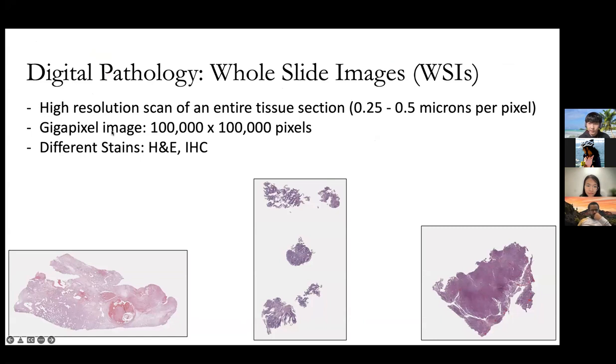As some folks might already know, there has been tremendous progress in whole slide imaging for histopathology over the past decade, so nowadays pathologists and researchers can view histological specimens at very high resolution right on their computers. Recent advances in computer vision and machine learning also helped fuel interest in large-scale quantitative image analysis of these images, both for knowledge discovery and to potentially assist in clinical decision-making. However, one of the challenges is that it's simply too computationally expensive, if not intractable, to perform inference on entire whole slide images, or WSIs, as I'll refer to them, in the raw pixel space.